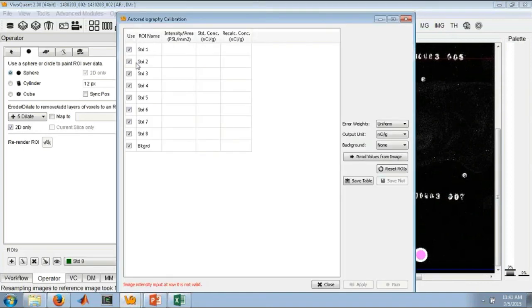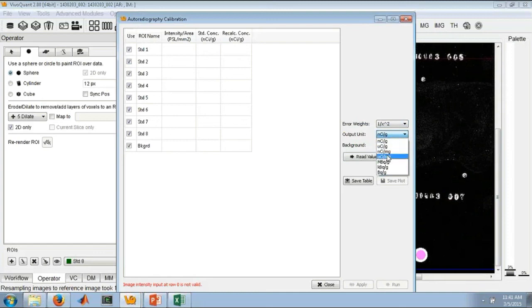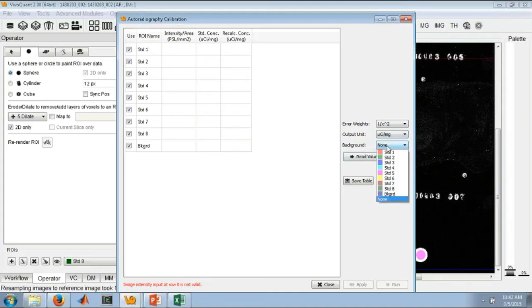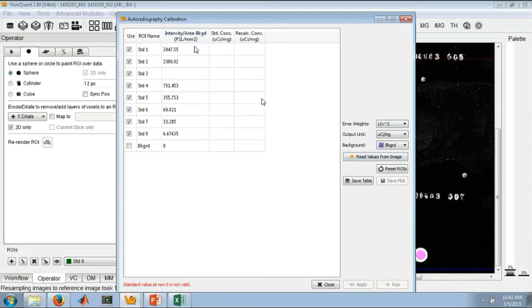Open the calibration window. I tell if I want to do any weighting, what my output unit should be. So this will be what you're calibrating to. We tell if there is a background. In this case, there is. And then we can read the values from the image. So now in this column, we have the PSL per millimeter squared values, or the raw values from the autorad data.